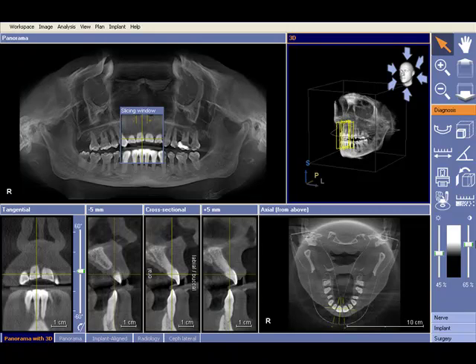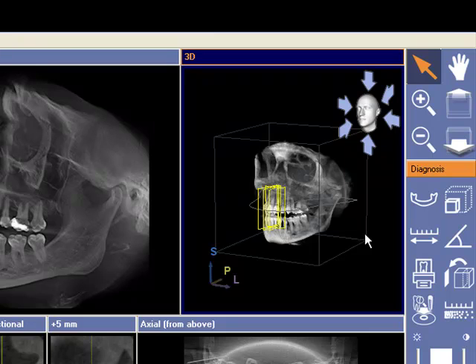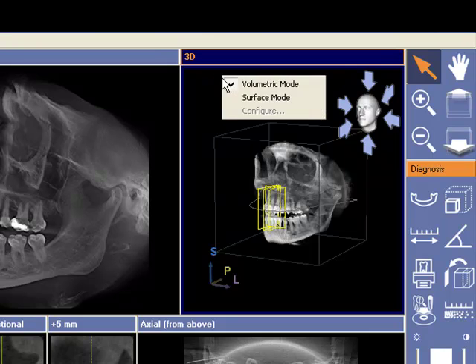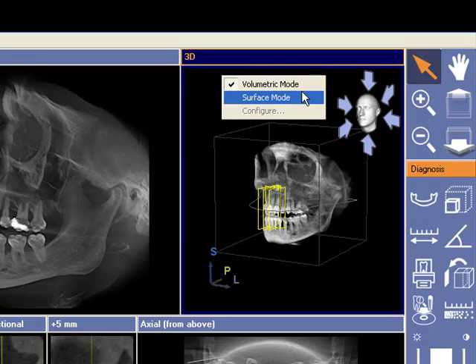In this example I'll be showing you how to change your 3D skull from volumetric mode into surface mode. This is our image here we'll be working with. Our window is highlighted dark blue and orange, which means it's active. Right mouse click to get the drop down menu — you can see we're in volumetric mode at the moment — then go down and left mouse click to hit surface mode.